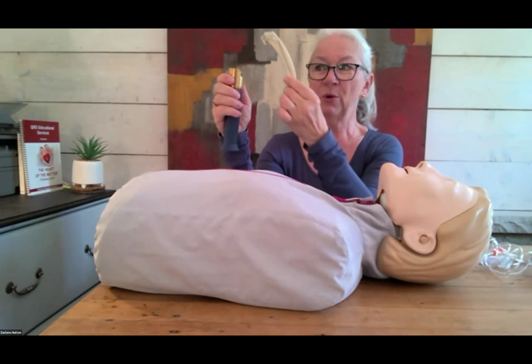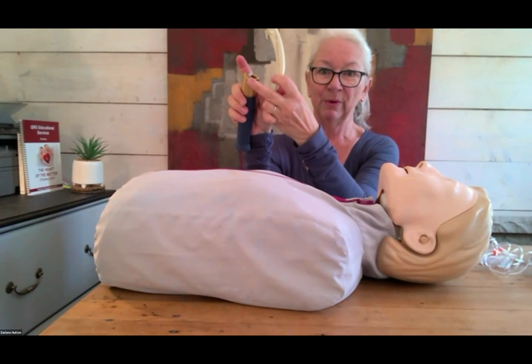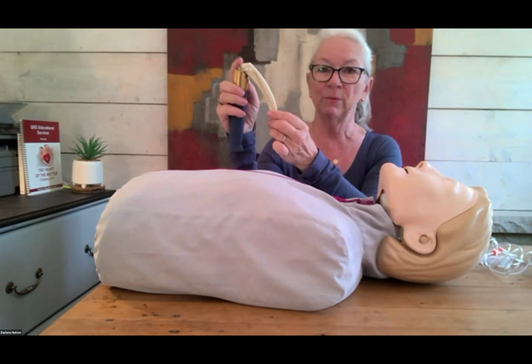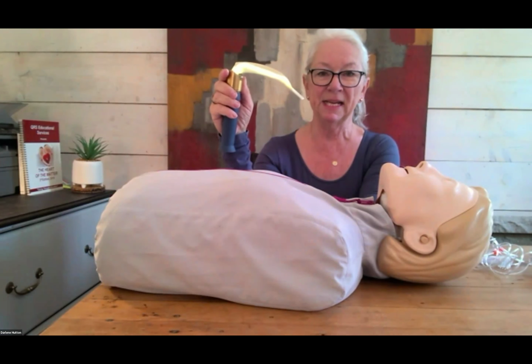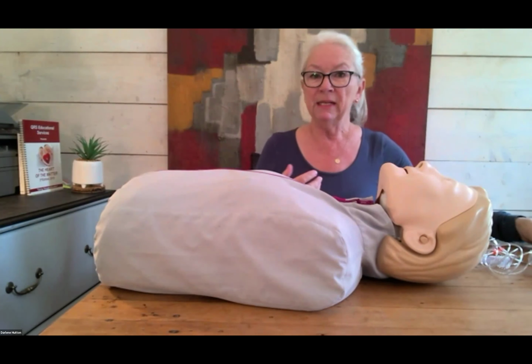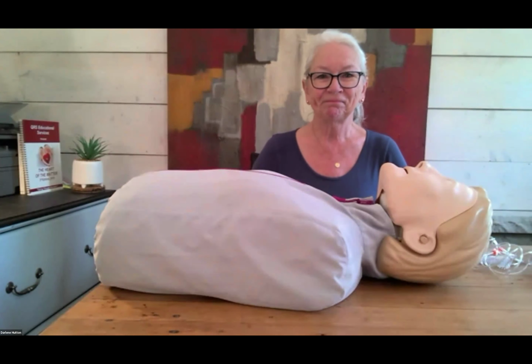To put it on, you're going to align this loop right here with this little line here, align it, and then once it's aligned with your finger, you are going to push. And just ensure that there is a light source there. You will need lubricant, and water-soluble lubricant is what we use. The O is for oxygen.